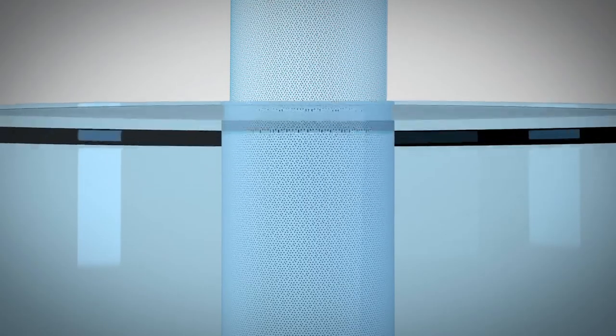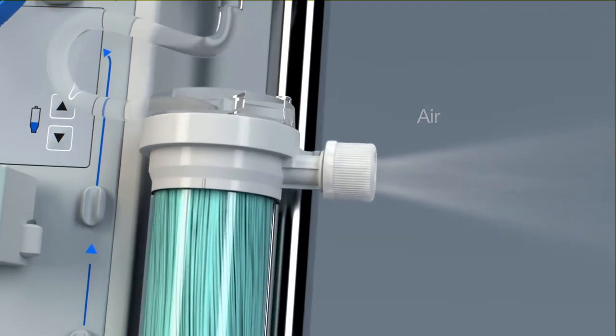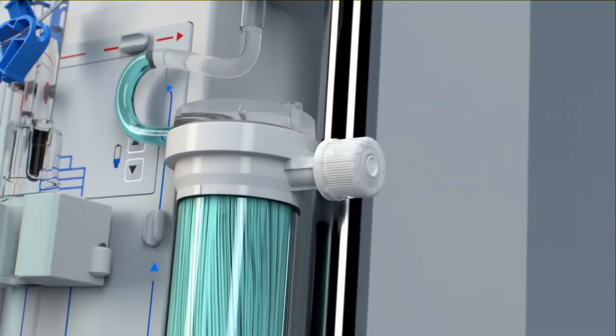During prime, as saline travels through the dialyzer filter, air is automatically purged from the dialysate compartment through the vented Hansen caps, removing all the air and creating an airtight seal.